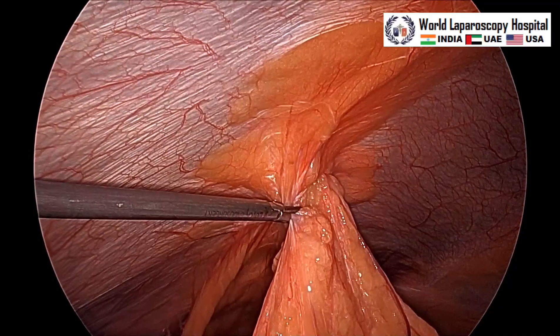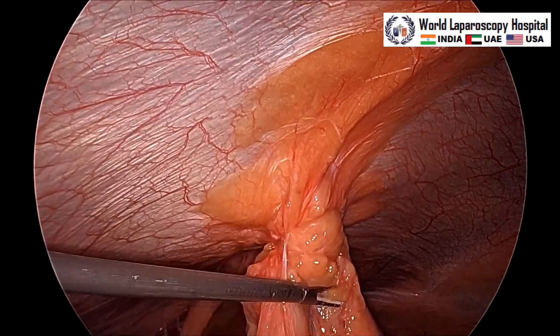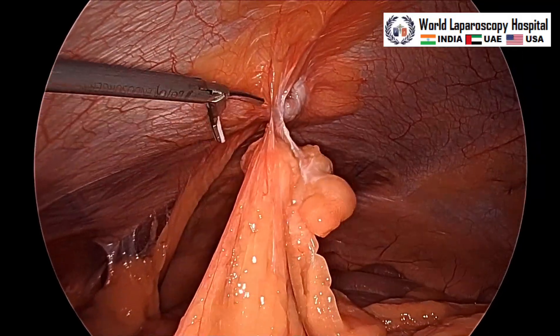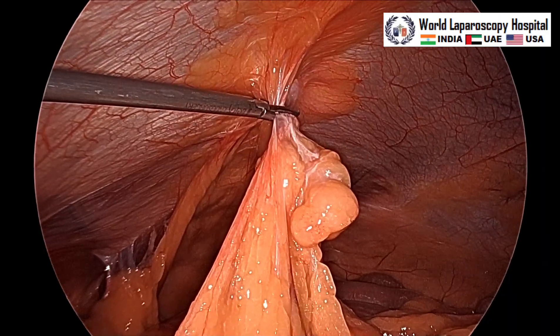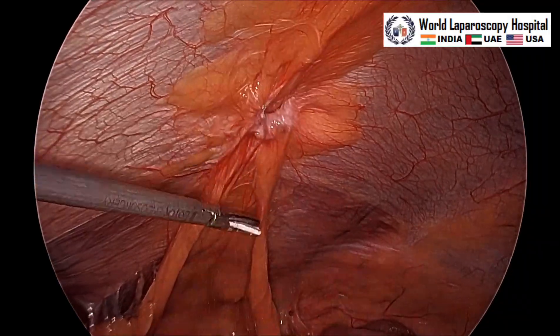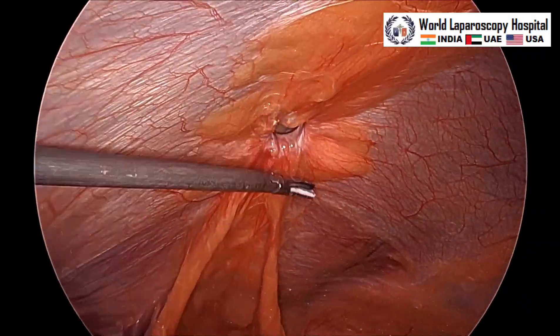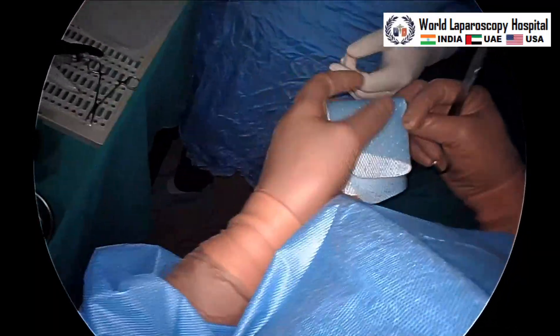The first step is that the content of the hernia has to be taken out. We can see there is some fat which is entering into the hernia, which is easily reduced. Only one 5-millimeter port for the instrument is used, and the same port we will use for fixation of the tacker as well.